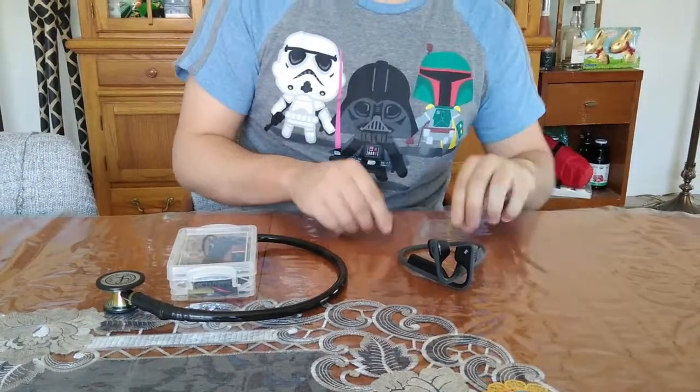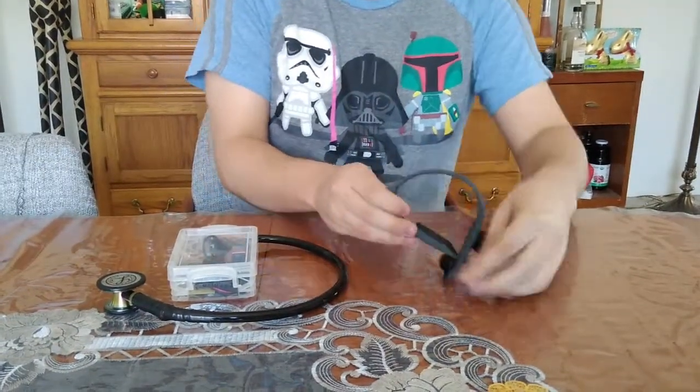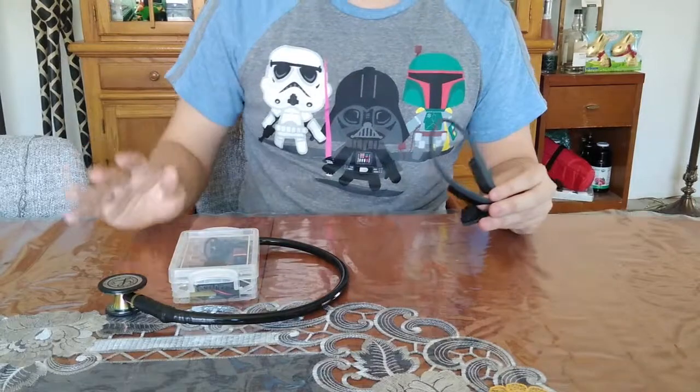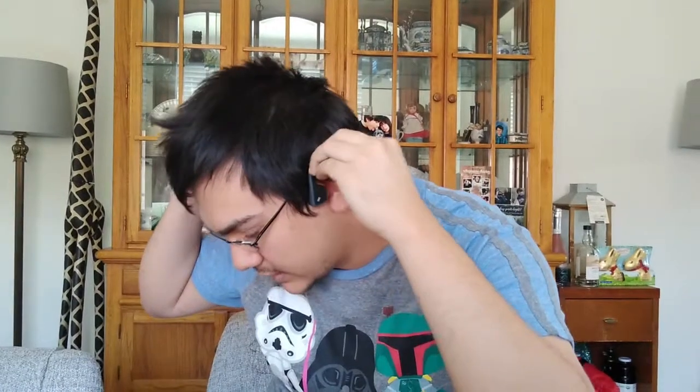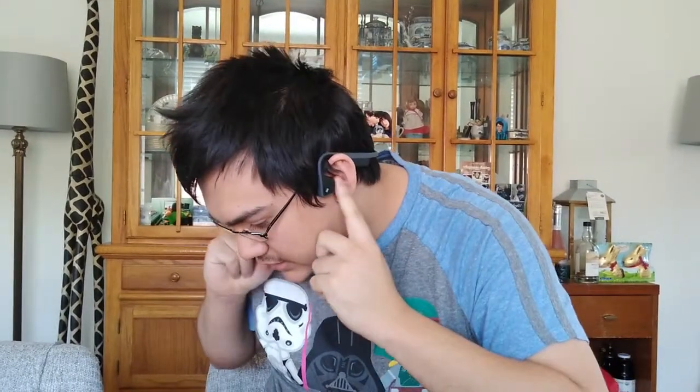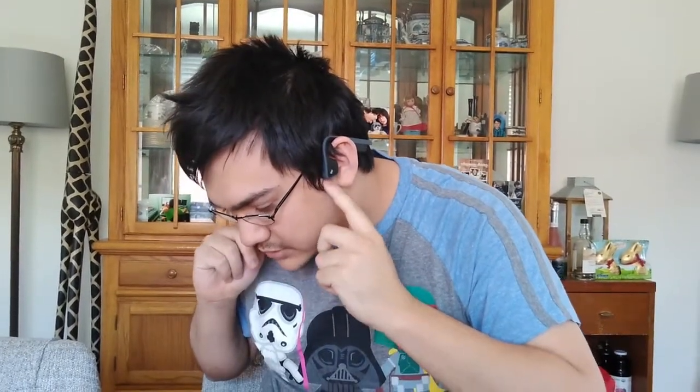I will now perform a demonstration. This uses Bluetooth and the devices are already paired together. The device goes over your head and hangs over your ears. It does not cover your ear holes since it vibrates your skull.